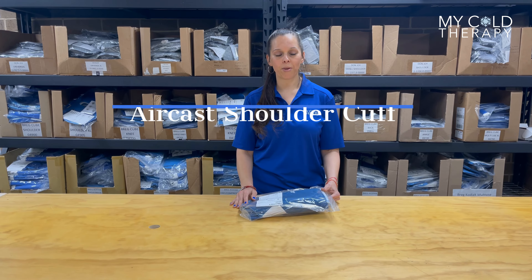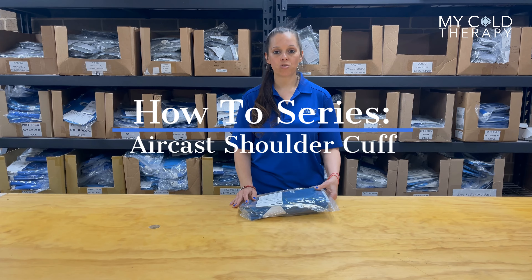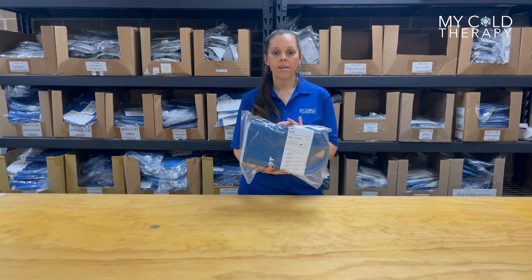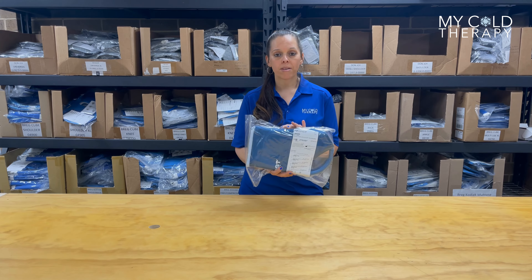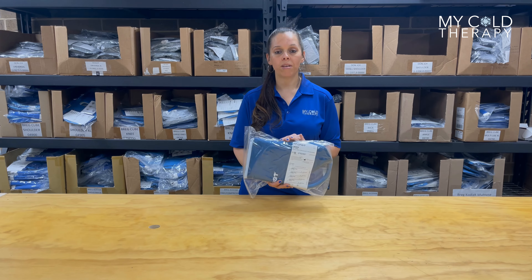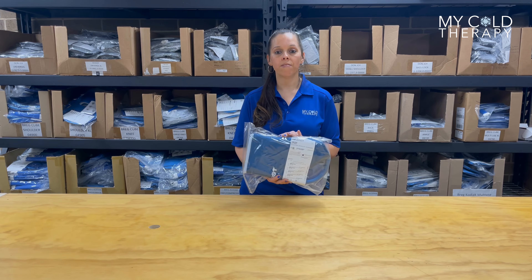Hey guys, Michelle here from MyColdTherapy and today we're going to demonstrate how to apply the AirCast shoulder cuff. For full specs on this product, visit our website www.mycoldtherapy.com and click on the link video library.